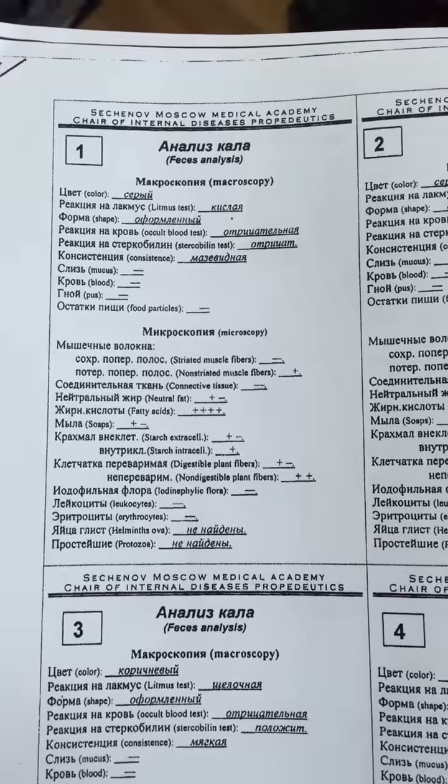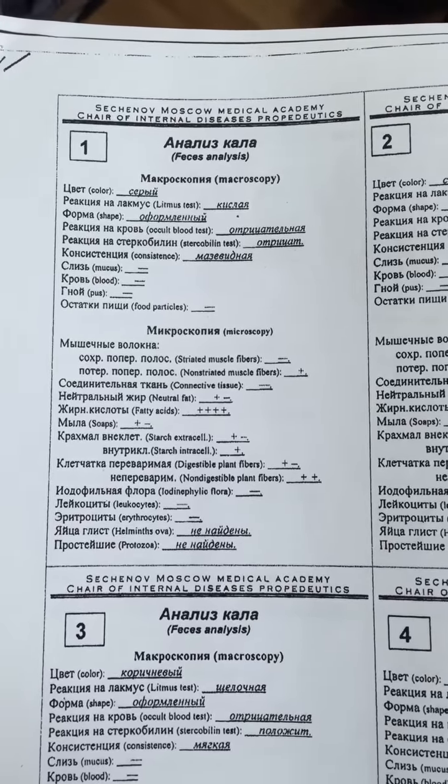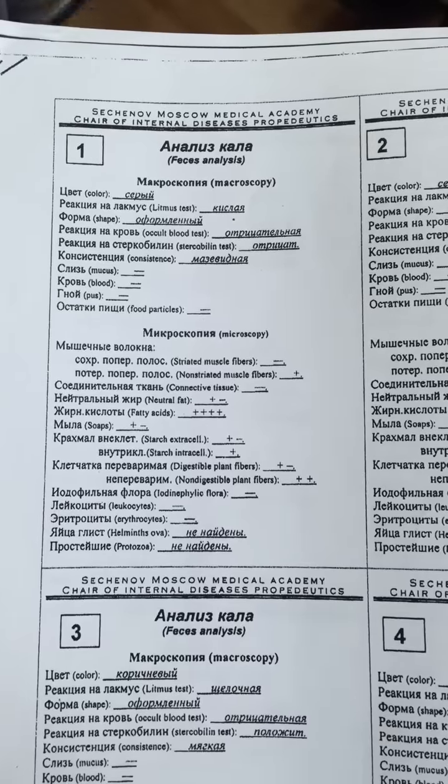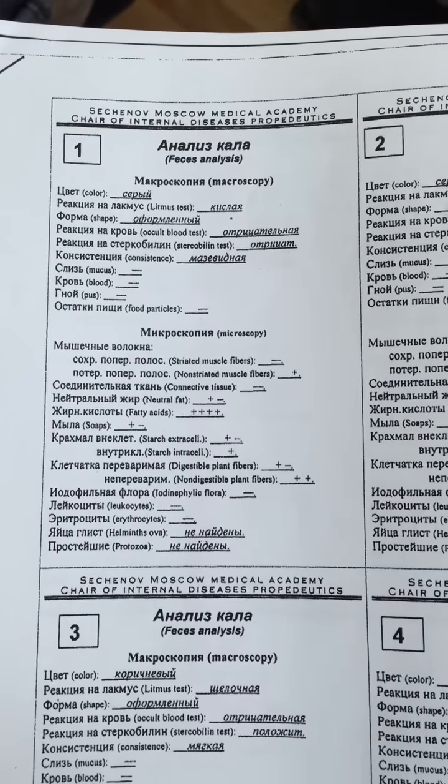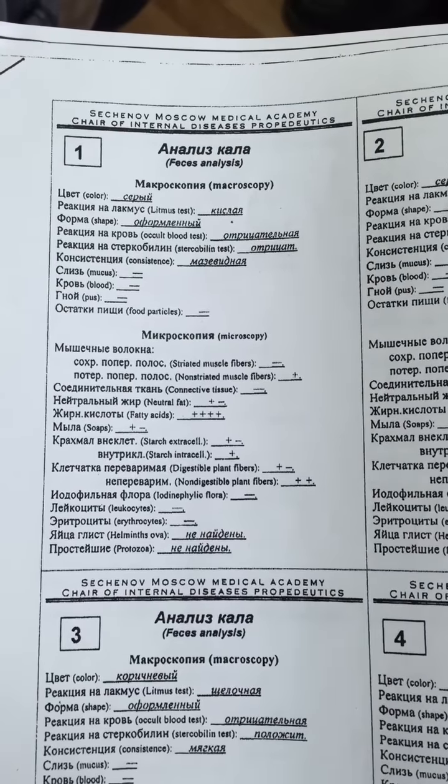Iodinophilic flora absent, leukocytes, erythrocytes absent, helminths, ova also absent, and protozoa also absent. What findings do we have here?